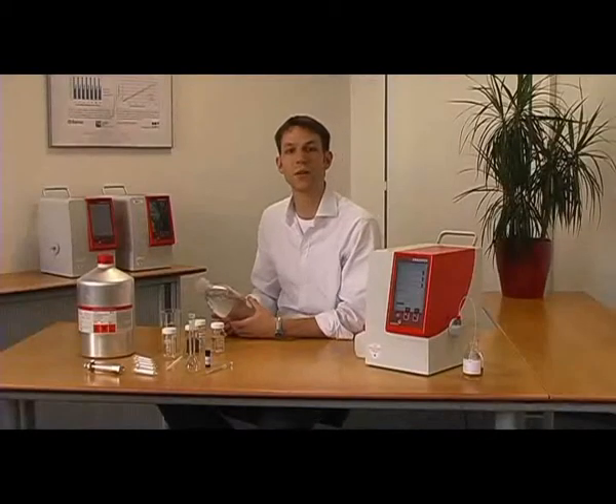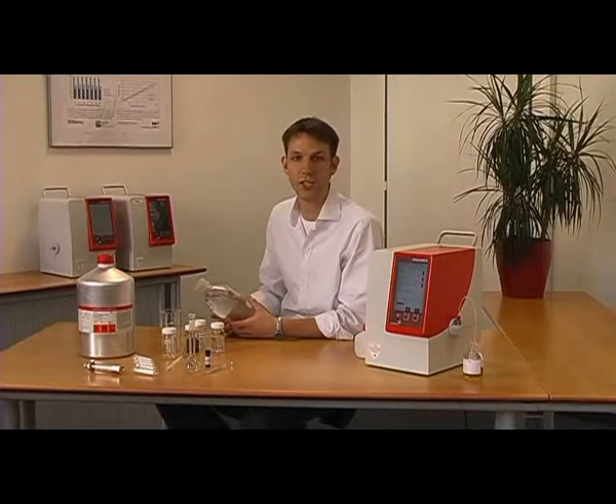Hi, my name is Leonhard. This video is designed to guide a presentation of the AeroCheck method.